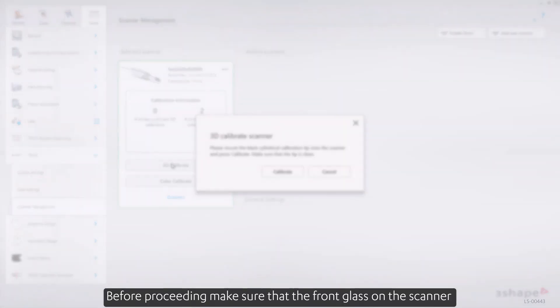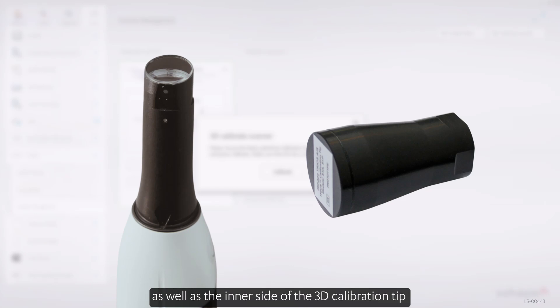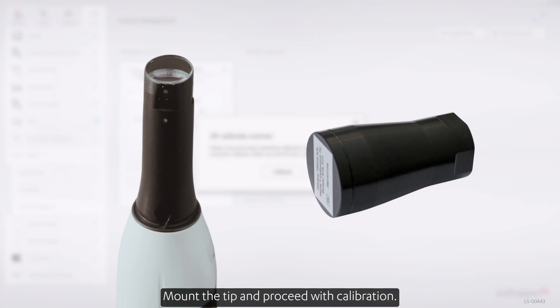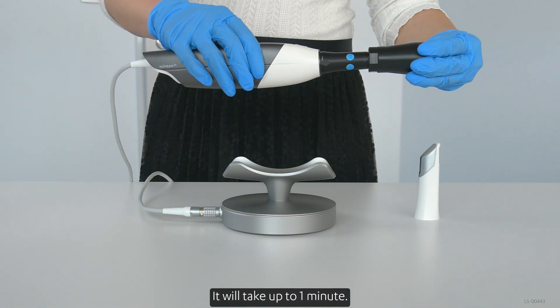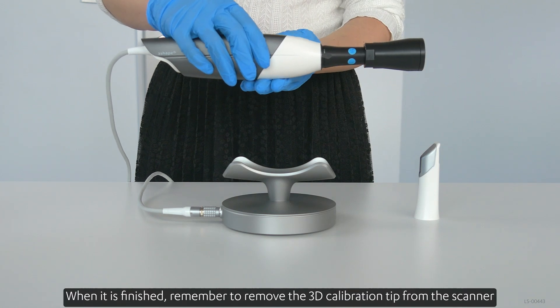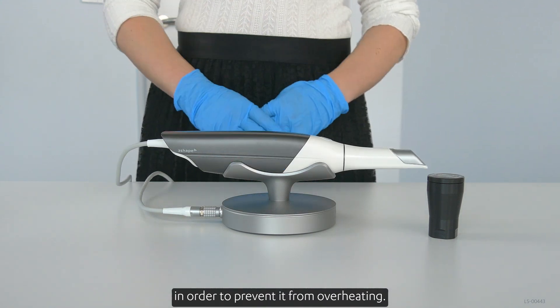Before proceeding, make sure that the front glass on the scanner, as well as the inner side of the 3D calibration tip, are clean and free of dust or scratches. Mount the tip and proceed with calibration. It will take up to one minute. When it is finished, remember to remove the 3D calibration tip from the scanner in order to prevent it from overheating.